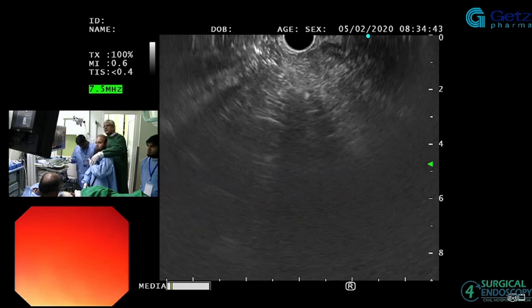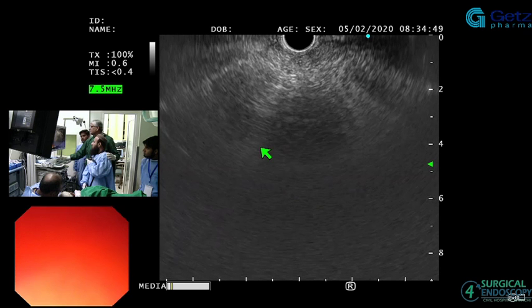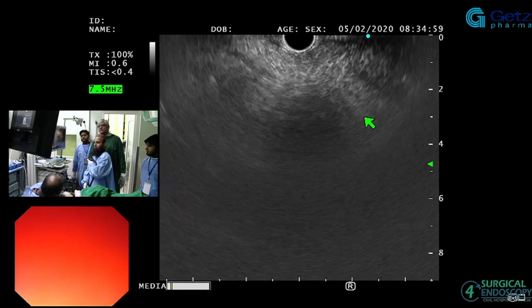Are we with you guys? So ducts in D2 coming in this area. This is one of the ducts that's coming, that should be the CBD. Now just gently let go of your big wheel. Thoda sa usko tip forward kare. Or no, clockwise rotation rakhe. You don't change your clockwise. If you tip down, then the rest of the things will change.